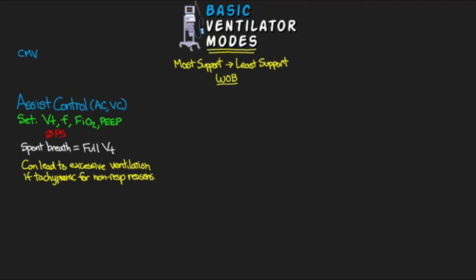Now, oftentimes though, we will initially use AC when we're intubating a patient, as we really have the full control over our patient's minute ventilation, as well as fully taking over their work of breathing.